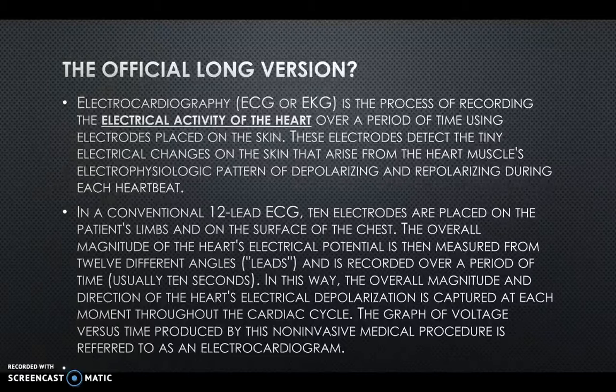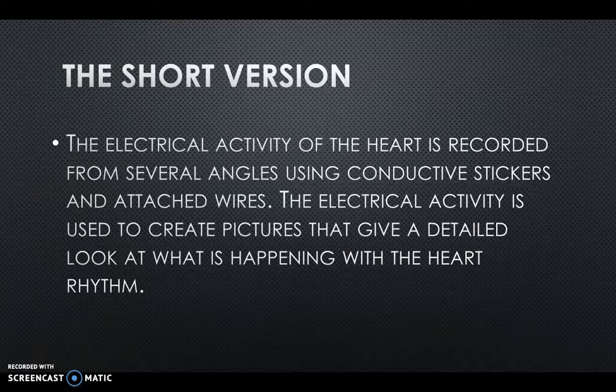Now that I've given a very long and very detailed look at what an EKG is, go ahead and wake up and I'll give you the short version. The short version is that the electrical activity of the heart is recorded from several angles using these conductive stickers you attach to the patient. The electrical activity is used to create pictures that give a detailed look at what's happening with the heart rhythm.